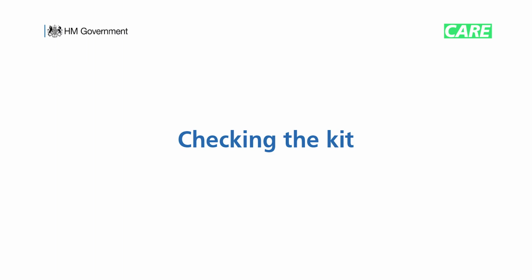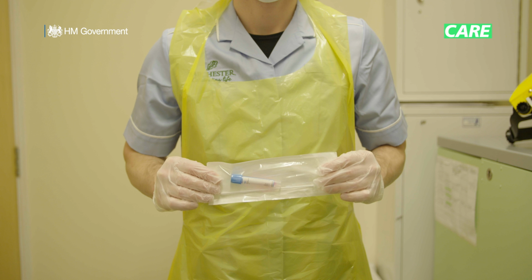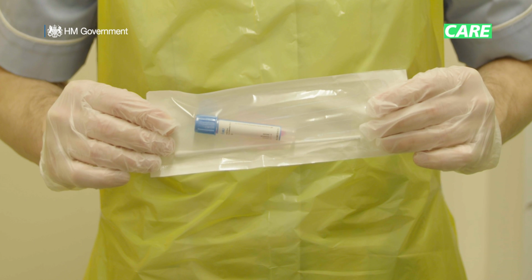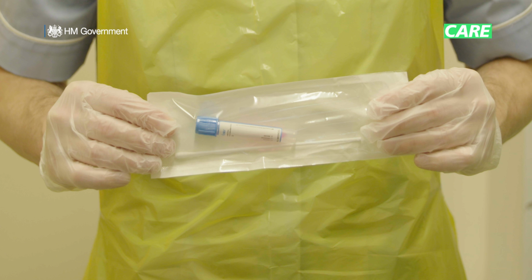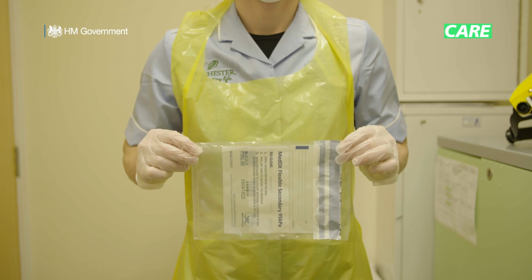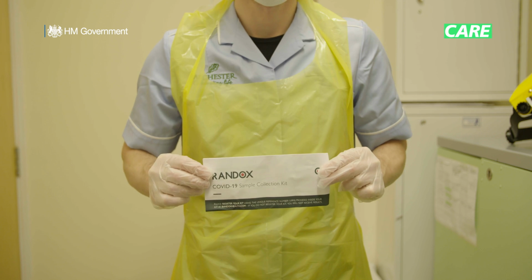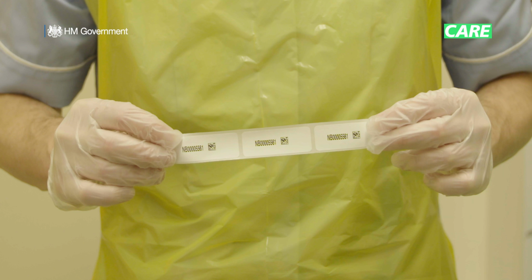You'll need to check that your kit contains all the necessary items. You should have a swab inside a sealed wrapper, one small sample collection vial that should contain a small amount of liquid, one transportation tube, one patho-seal bag, one large envelope, an instruction booklet, one sheet containing labels with barcodes, as well as a unique reference number.